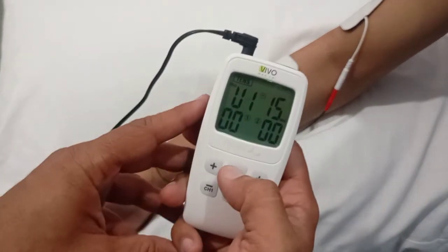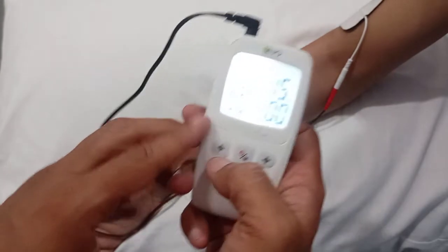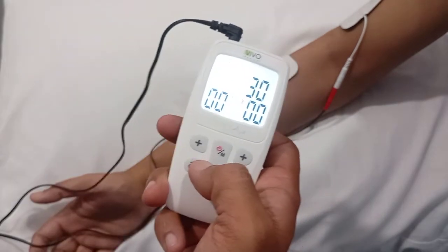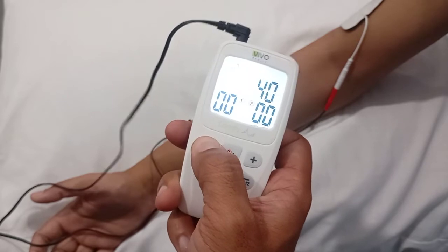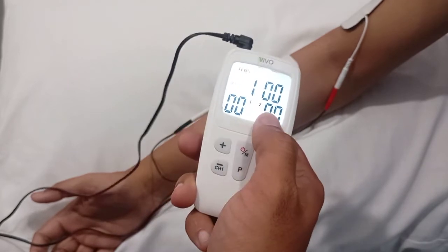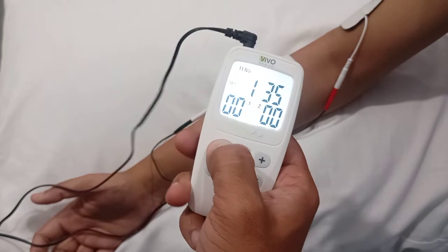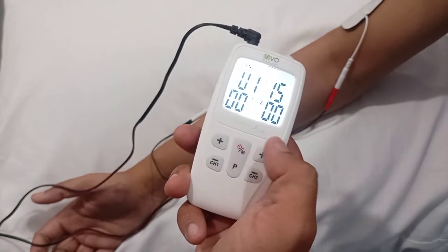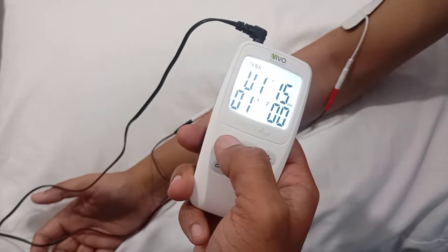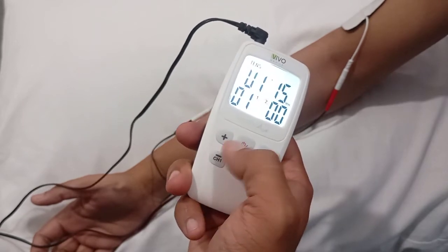I've turned on the TENS unit and selected the user defined program one. The treatment time can be 15 minutes. Since this is acute, we increase the frequency to more than 50 — let's keep it at 55 Hz on day one. Because this is a small region, we'll set the pulse width to about 150 microseconds. Then press the menu or power key. For acute conditions, a minimum perceptible intensity of one or two can be sufficient.